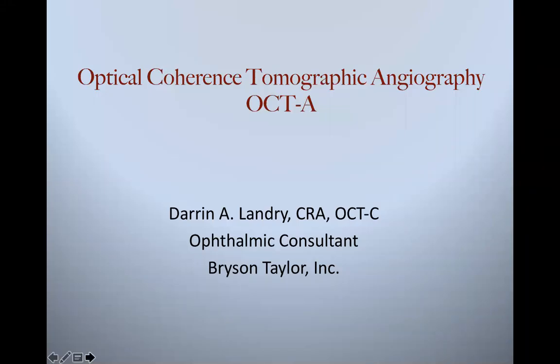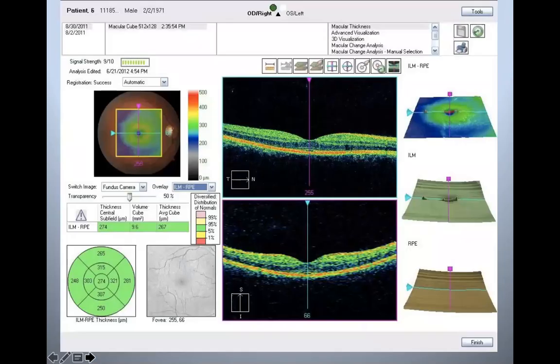Today, we're going to be discussing optical coherence tomographic angiography, OCT-A or OCT angiography. Now, most of us are pretty familiar with OCT in ophthalmic practices. It's the most widely used diagnostic tool, not only for making initial diagnosis of retinal pathology, but also to follow treatment and see if there's any change in that retinal pathology.